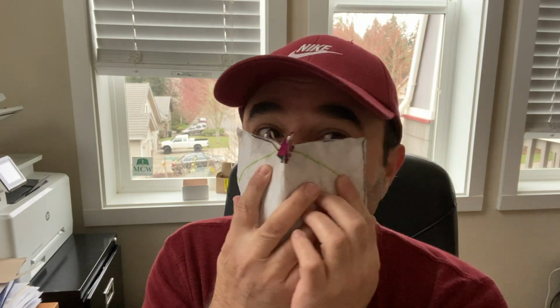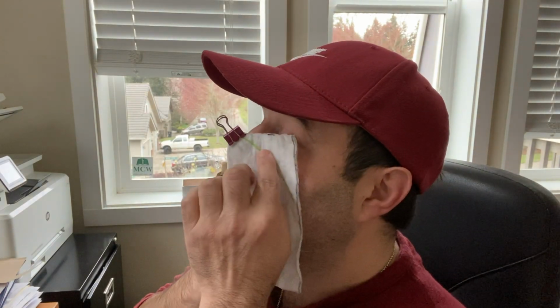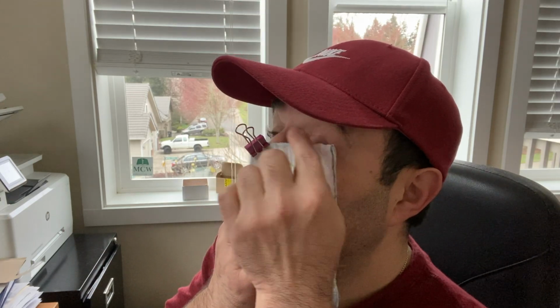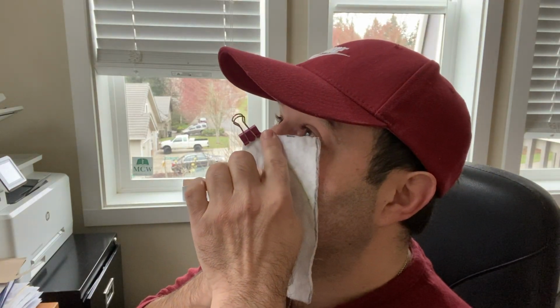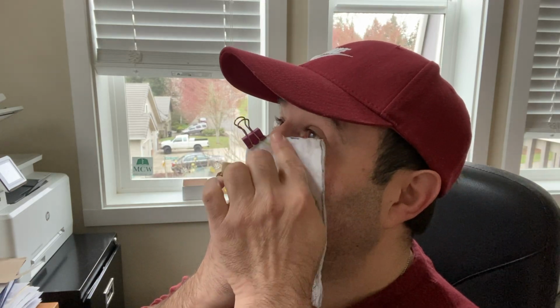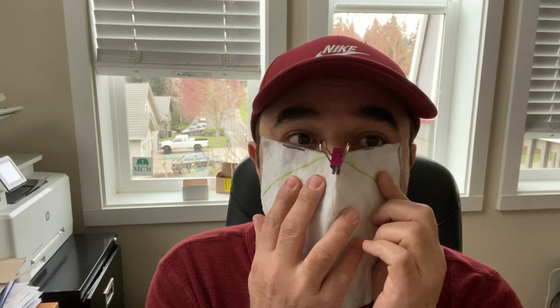Once you've done that, the next thing you do is that you may need some help with this, but you'll want to trace out how you want the filter to lay along your cheekbone, because obviously this part is obstructing your vision. As you can see here, I put my mark here of how I want it to lay across my cheekbone, so that when it's being pushed against my face, it's providing maximal coverage to this area. And you don't have to do it on both sides. I'm just using this to show you.